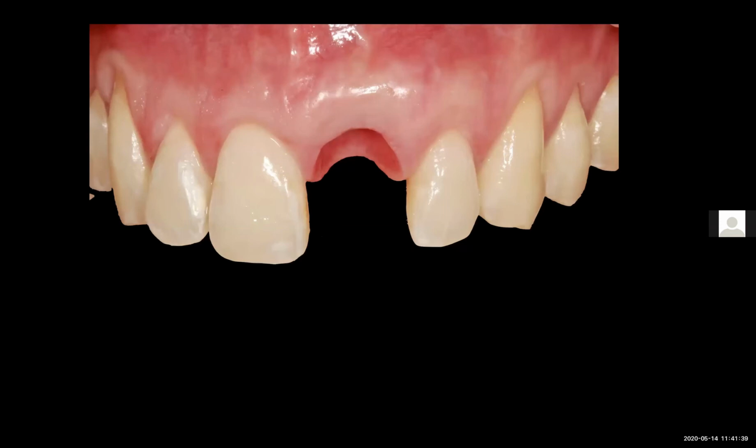This photo was taken at the final impression appointment, and again, the peri-implant tissue healed remarkably. By having the ability to place immediate implants and immediate screw-retained provisionals, we were able to preserve full natural papillary height and maintain that positive facial gingival contour. And look at it now, I think we even managed to gain some tissue height.